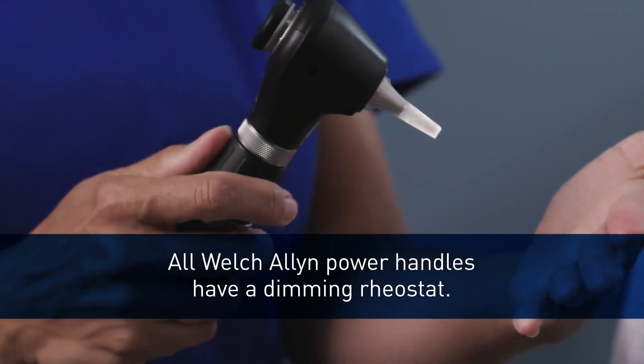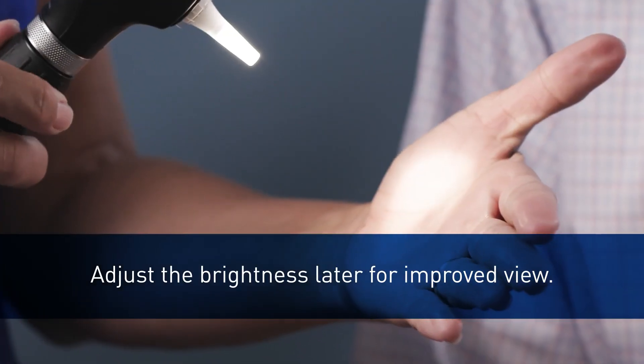All Welch Allyn power handles have a dimming rheostat. To start, turn the scope on to full intensity. You may want to adjust the brightness later for an improved view.